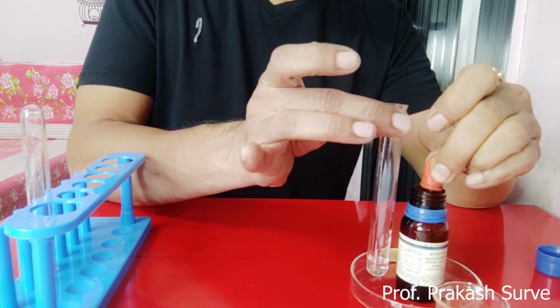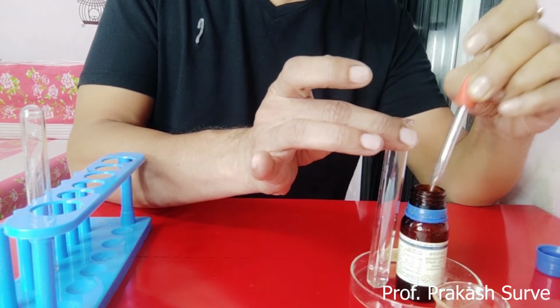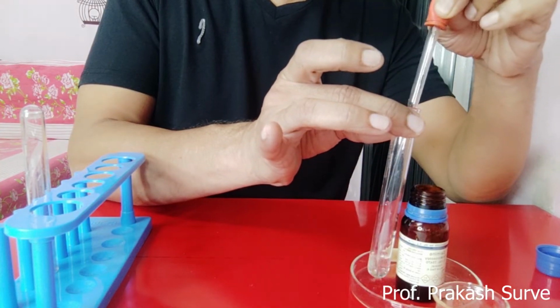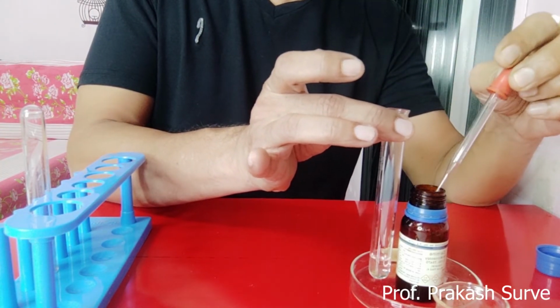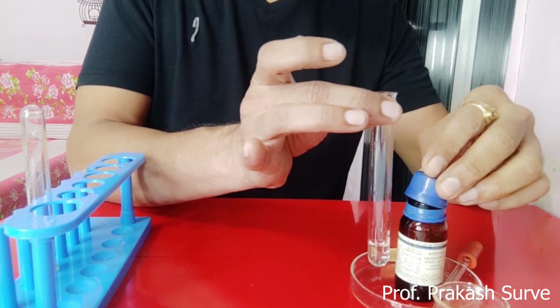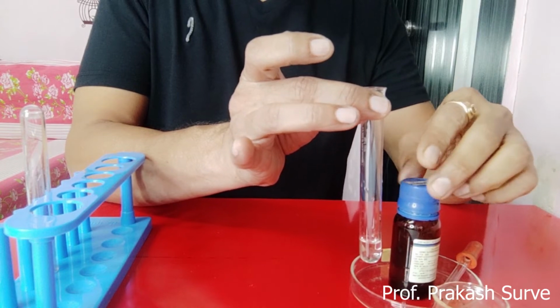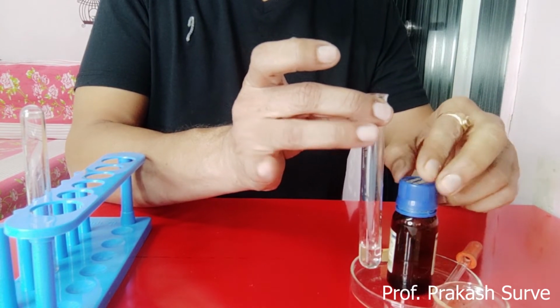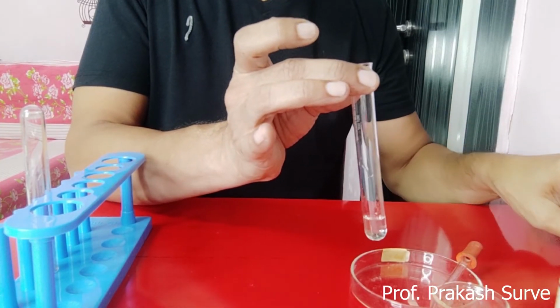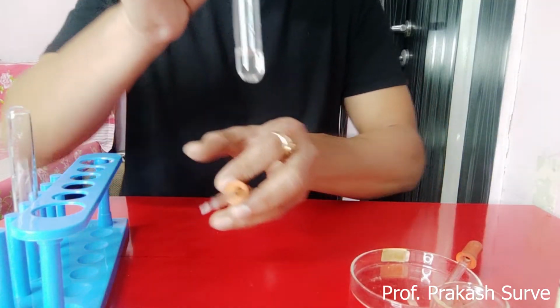Now we have taken the nitric acid in the test tube. Approximately it is 2 ml. Now the same quantity of urine sample, I will pour in this.